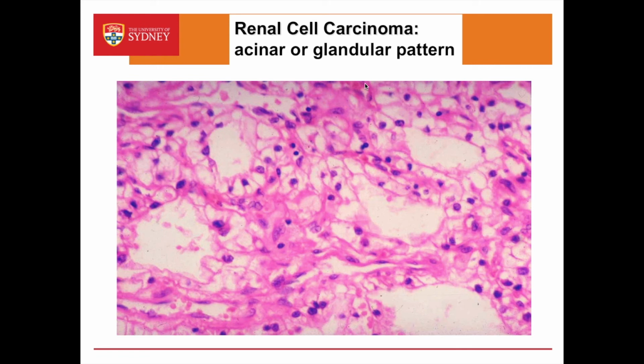The pattern or key characteristics of the microscopic structure are referred to as an acinar or glandular pattern. Again, a hematoxylin and eosin stained section taken from the developing tumour shows a proliferation of tubule epithelia, and this is characteristic of this cancer.